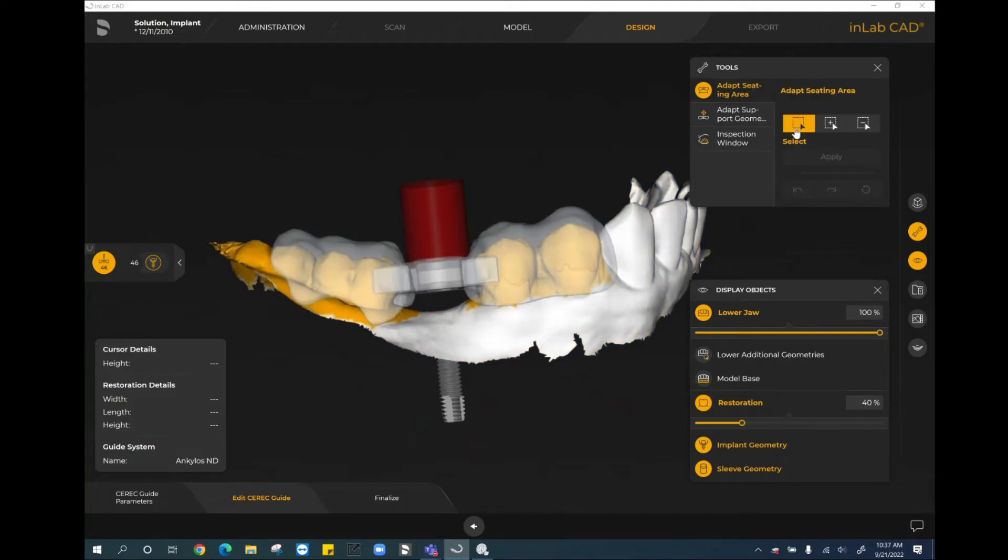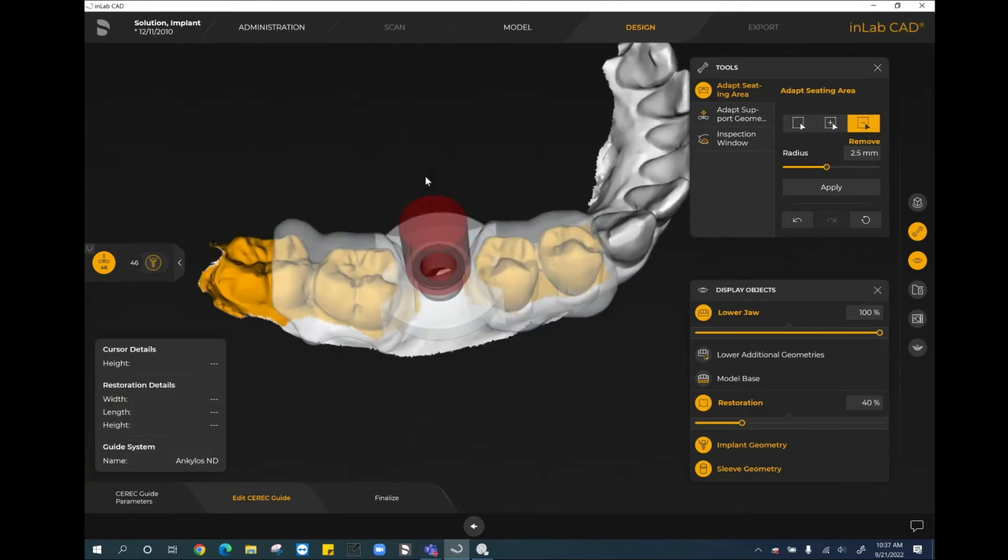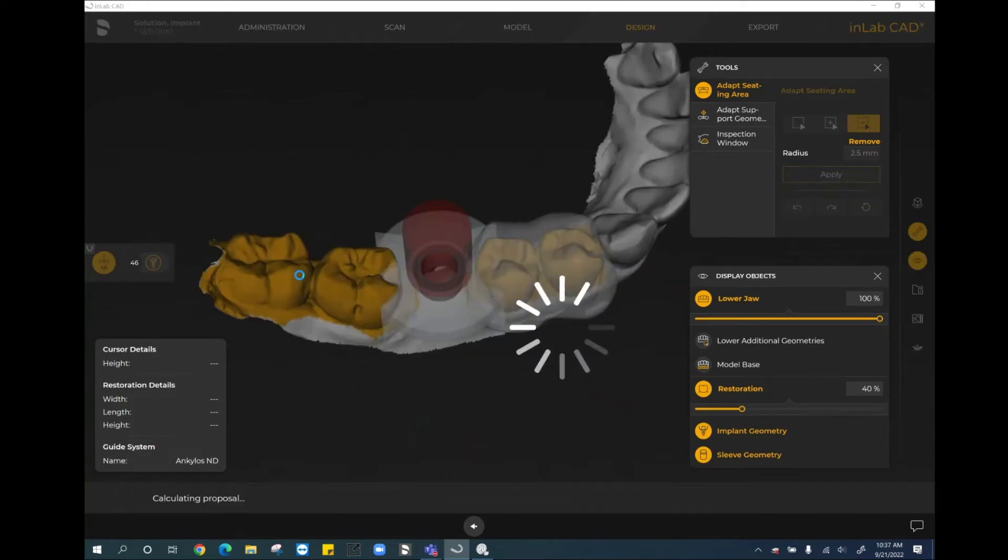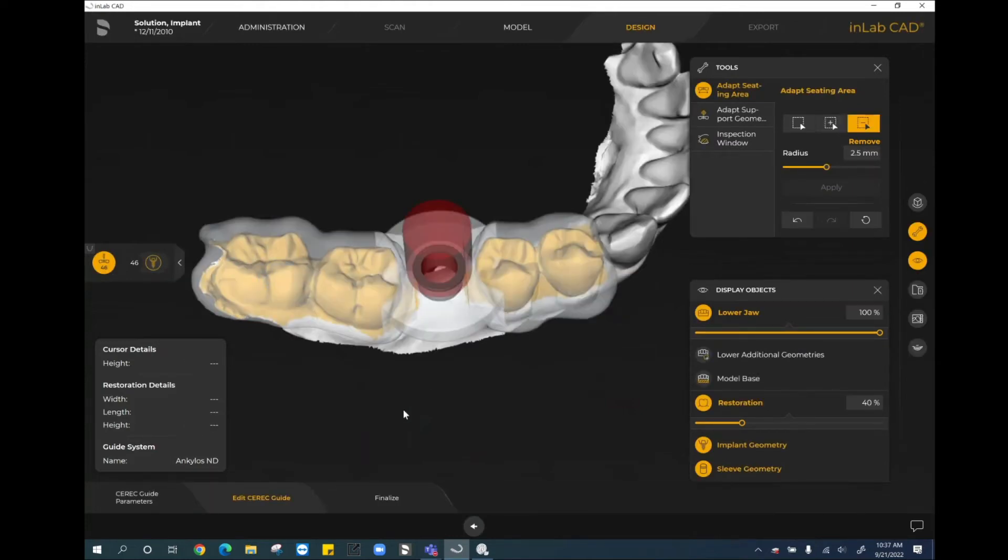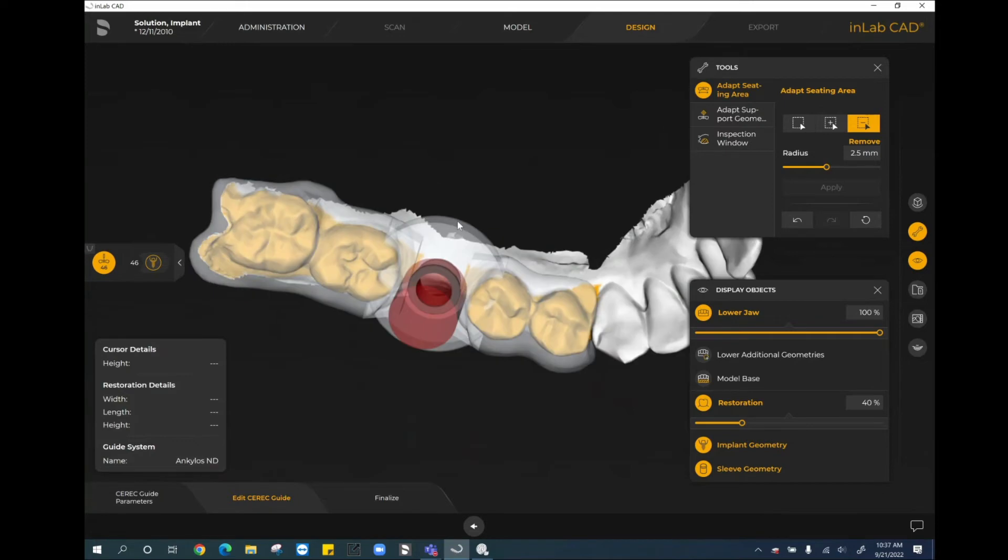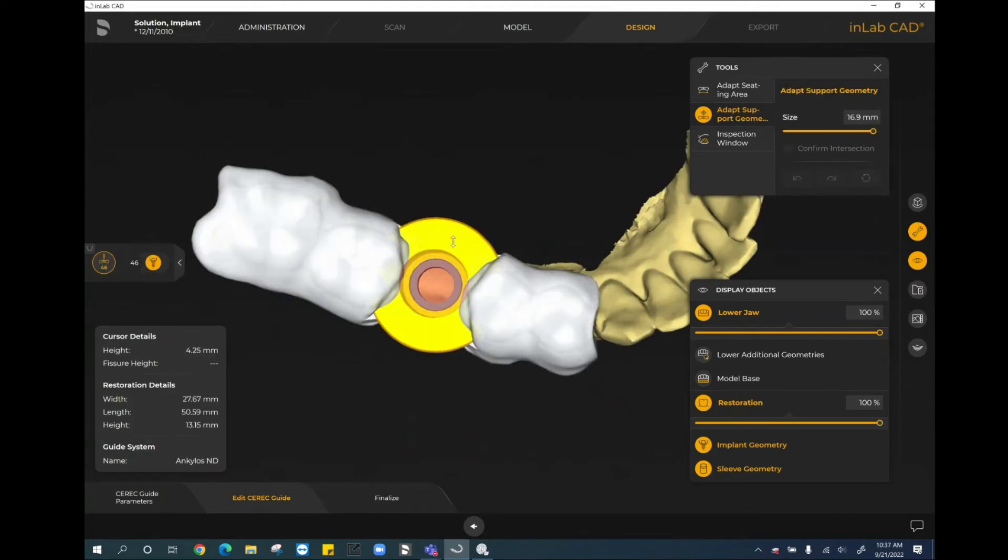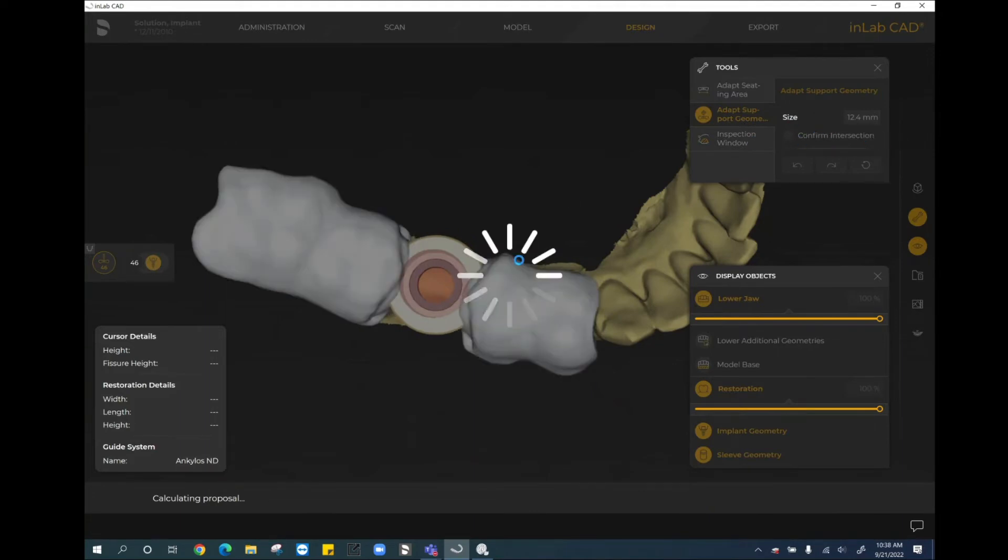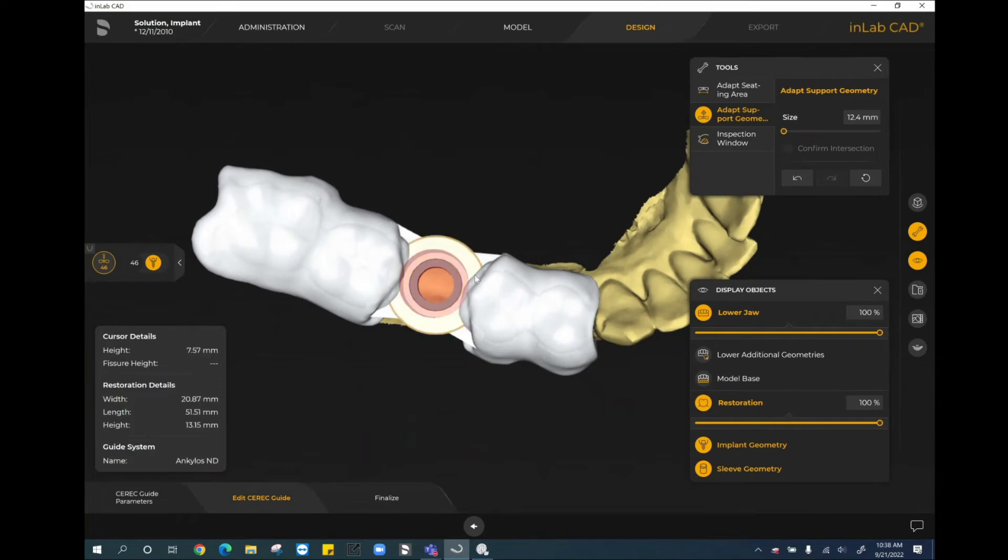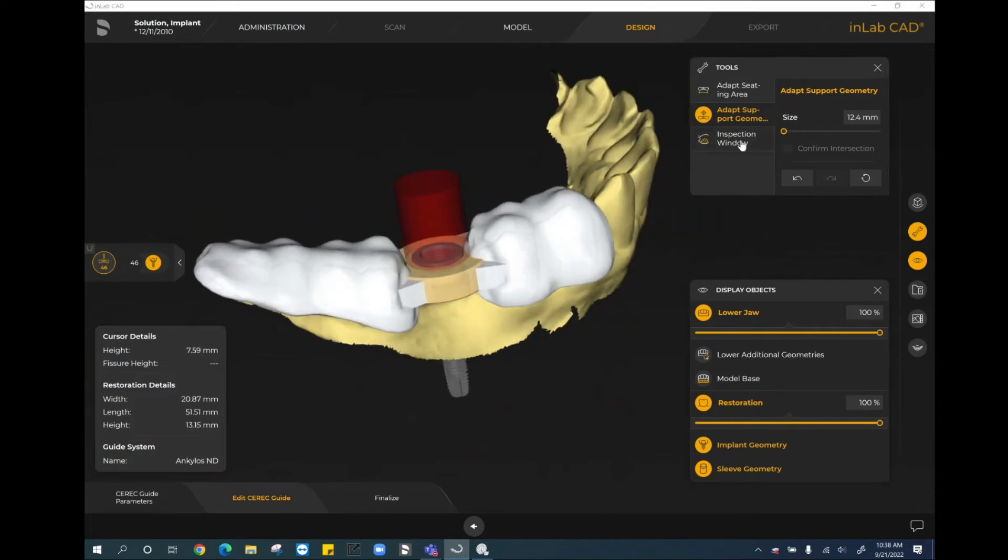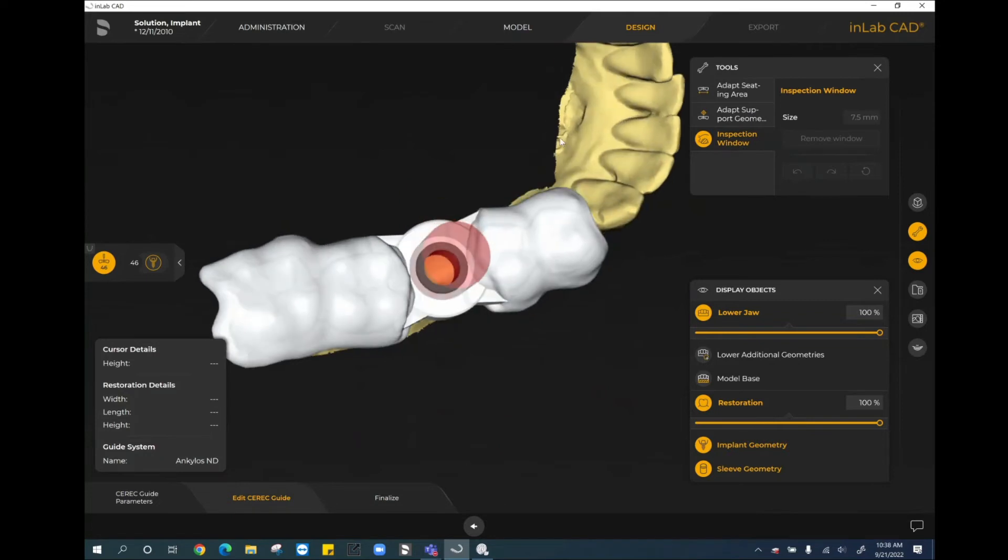I do want to just go through the tools from start to finish. The adapt seating area - what we're able to do if we wanted to add material, we can add resin or basically resin to these areas or we can remove as well too. If I use the remove tool, I can basically just come up and remove some of the area that it's going to adapt to, and then I can hit apply. Anything with orange, it's going to add additional seat to that area. Anywhere that I highlighted with the remove tool and then hit apply, it removed material from that area. Looking at this channel here, what we can do is where the support geometry is. If I wanted to decrease the size of this channel, I can either come to the right hand side and use that scroll button, or I can hold my left cursor and move my mouse down. You'll notice that we still have that red in the channel itself, and that's because there is still material here technically impinging.